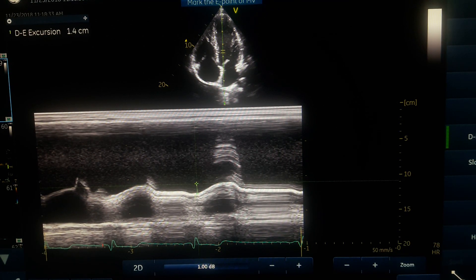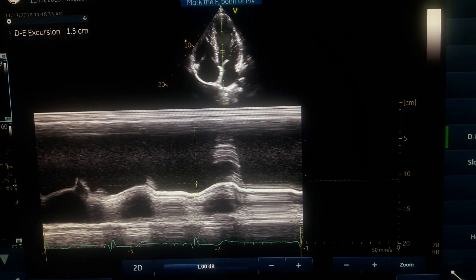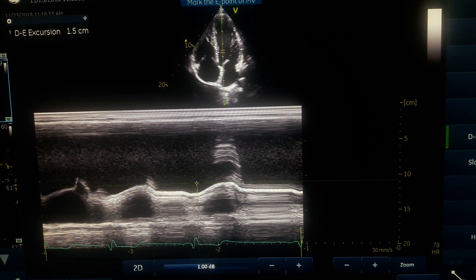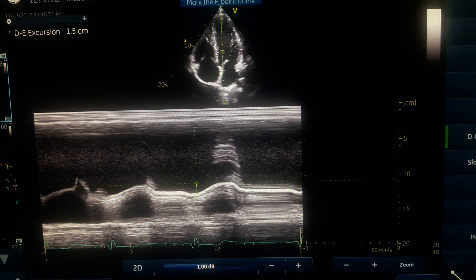The normal range for MAPSE is 12 to 15 millimeters. If the medial annulus excursion is less than 8 millimeters, it usually indicates a left ventricular ejection fraction less than 50%. For the anterior annulus excursion, go to the apical two-chamber view, place the cursor at the anterior mitral annulus, hit M-mode, and obtain that measurement as well.